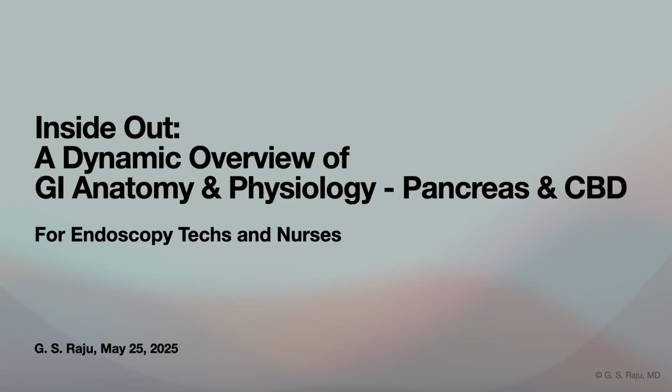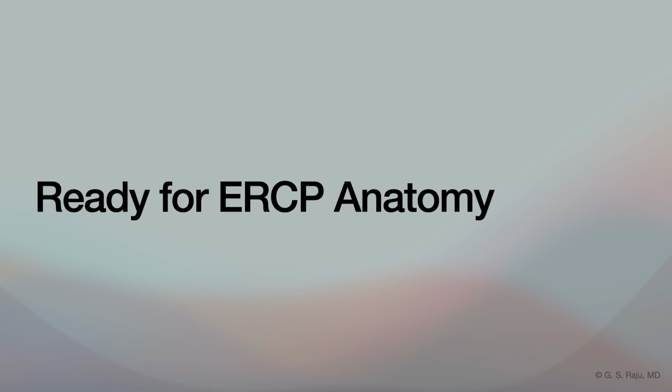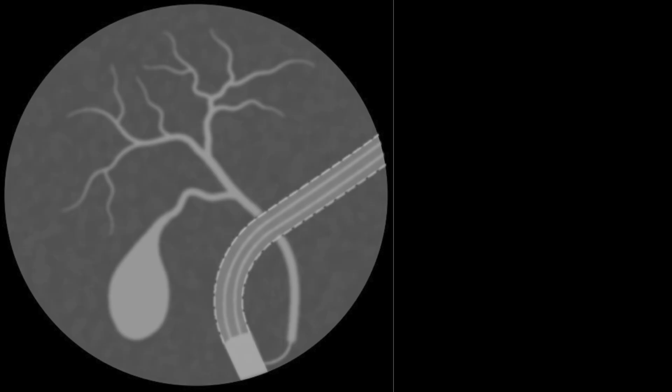Greetings. Let us talk about what you need to understand when you go into the ERCP room as a nurse or a technician. You need to appreciate what you see on the fluoroscopy monitor when your endoscopist injects dye into the bile duct. So, this is what it looks like.